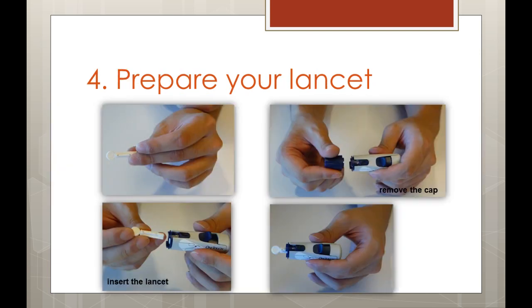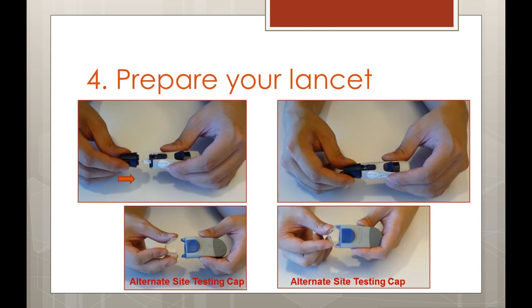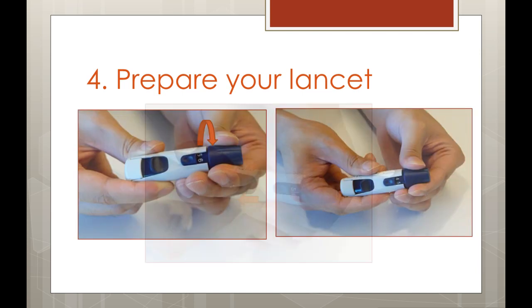To prepare the lancet device, we first need to get a sterile lancet. Next, remove the cap on the lancet device and insert the lancet firmly. Twist the protective disc off to expose the lancet tip, and be sure to keep the protective disc for later use. Finally, replace the cap on the lancet device. If you are using an alternative site, use your alternate site testing cap provided with your glucometer. After inserting the lancet, cock the lancet device until it clicks. If the lancet was already inserted firmly, you may not hear a click at this time.